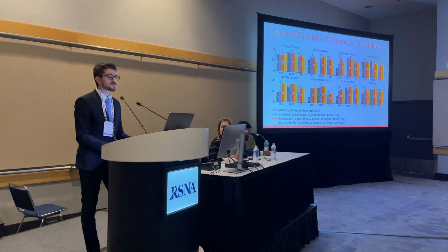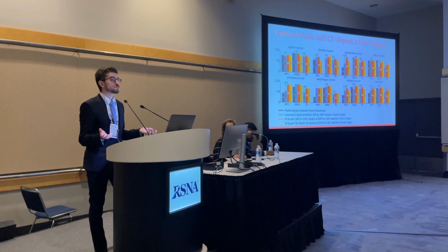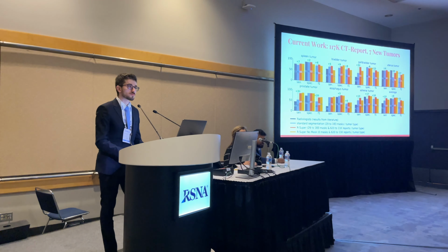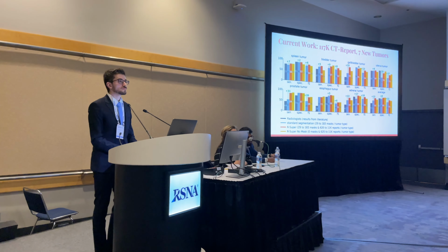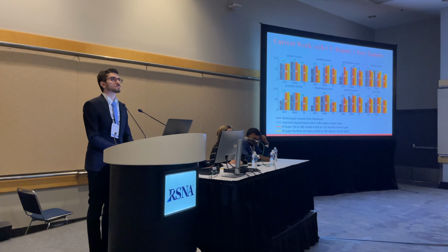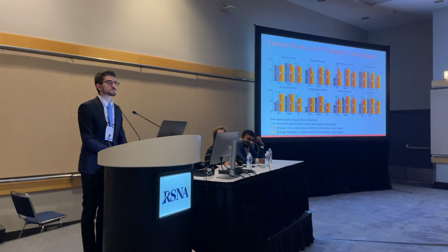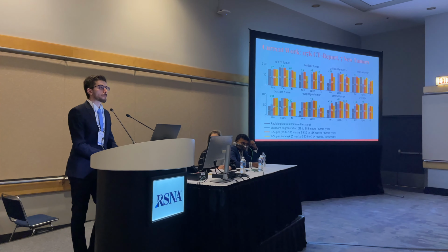For MRI, I think there would be no difficulty in implementing this because it's really similar to CT, the spacing, the 3D scheme, the reports are similar. So yes, I think this would be directly applied to MRI. For multi-label, let's say there's edema and cysts and the non-contrast and contrast regions of the MRI. Also, I'm sure you encounter the contrast technique with CT. And have you ever seen the performance on a multi-label dataset?